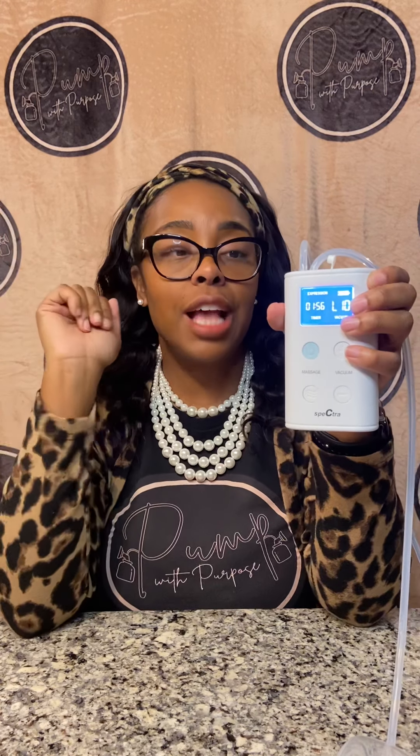It charges — it has the charging pieces here. It does also come with bottles, just like the Spectra collection, where you put on the bottle with the cap and not the nipple on top. To turn it off, you just hold the button down, let it up, and it turns off.